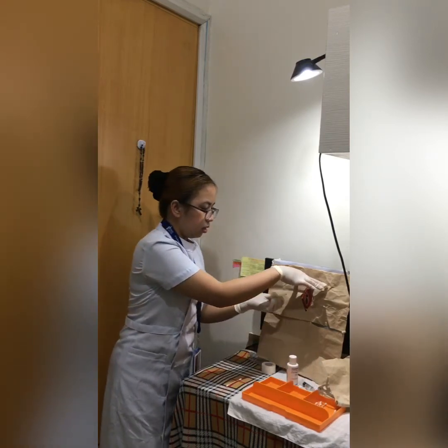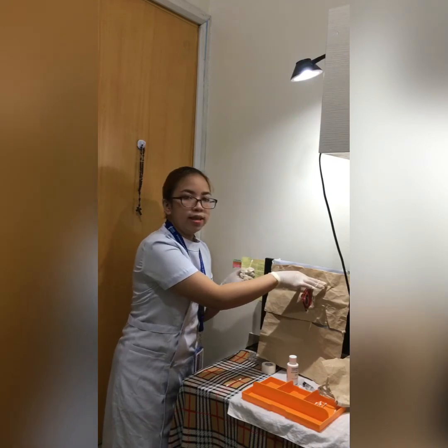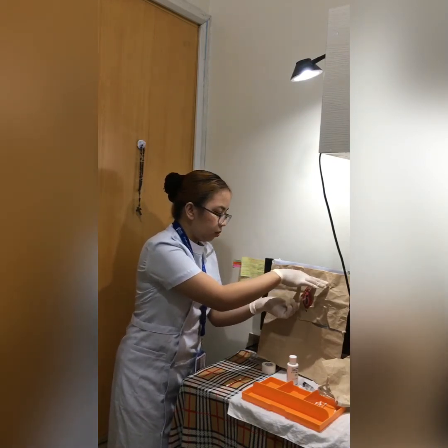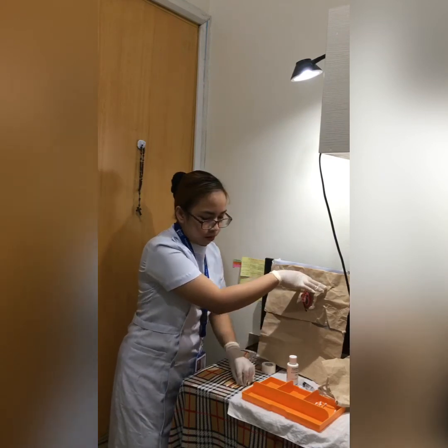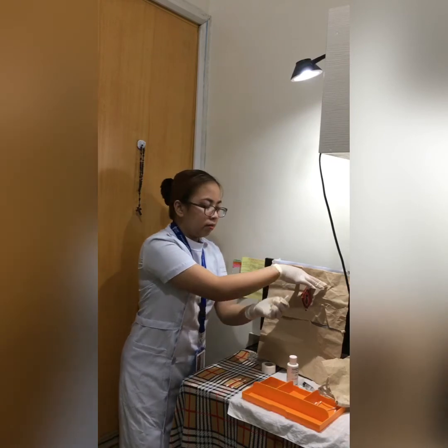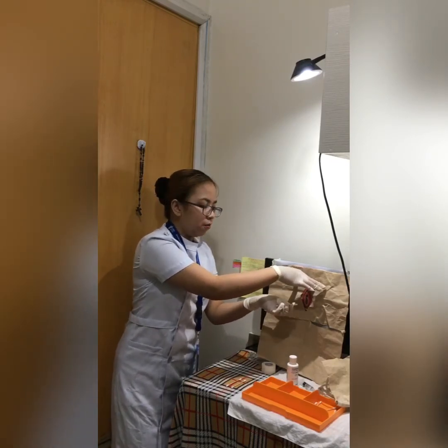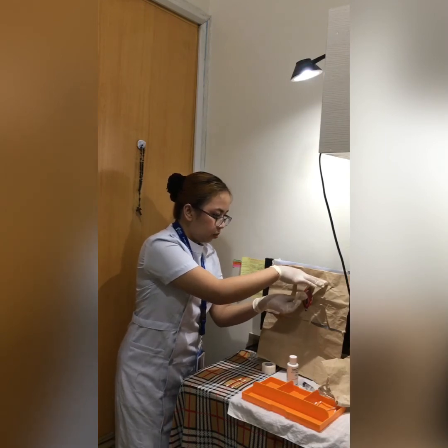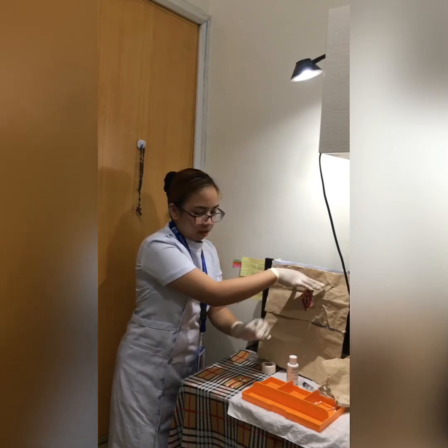Next, on the side that is near me, one swab, discard. Next, on the middle side of the perineal area, one swab, then discard.